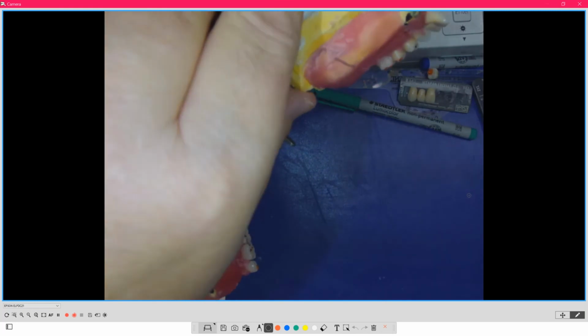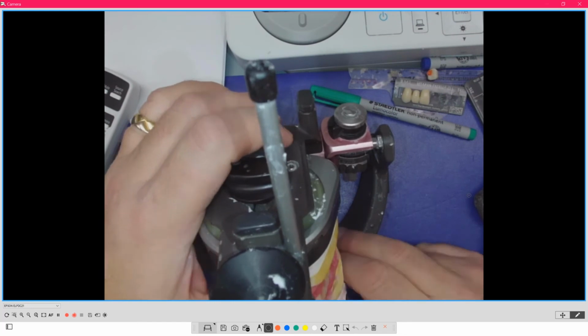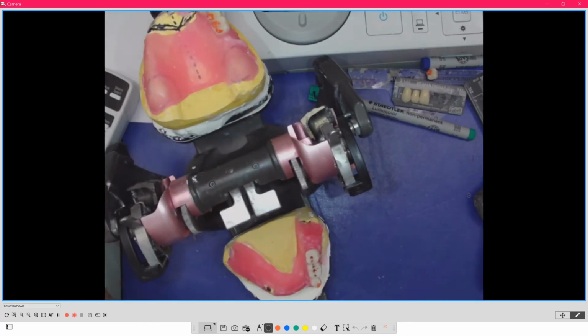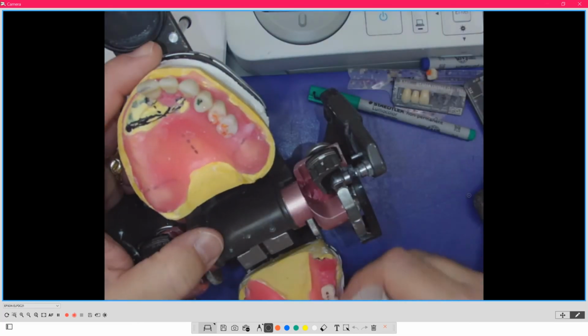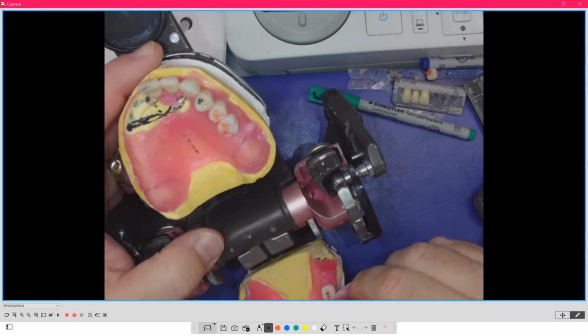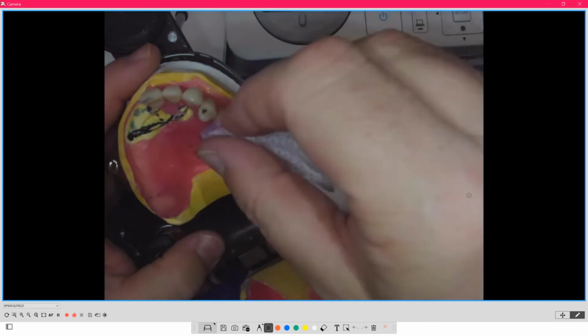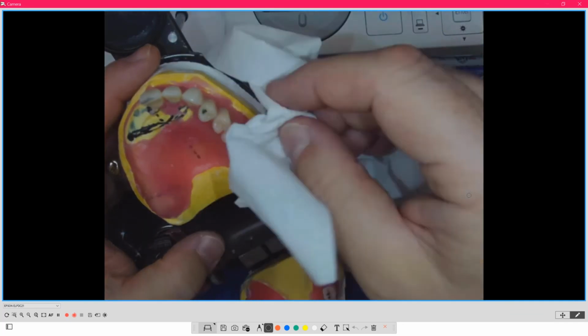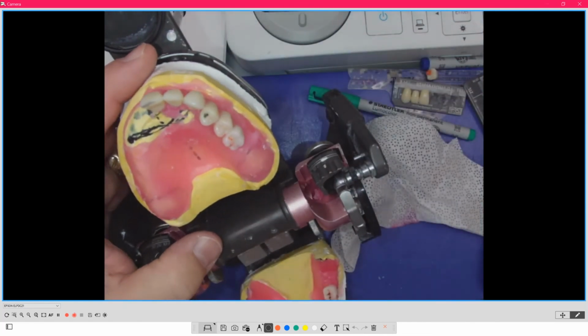Then I wanted to introduce you to a chew cycle to say, look, everyone chews in a certain manner. Just like you have a fingerprint, just like you have a retinal scan, you have a chew cycle. And that chew cycle is unique to you, and you function within that chew cycle. And then I wanted to introduce you to how you manipulate and move an articulator to mimic that chew cycle, and now try to identify that chew cycle. So again, I showed you some innovative ways to identify that chew cycle so that you can start to do that in the lab.